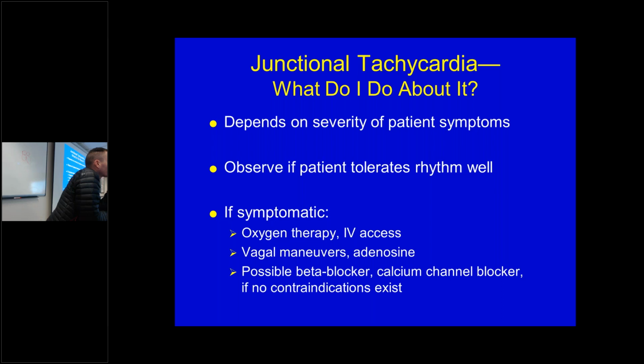Okay. You guys want to go over some practice strips?